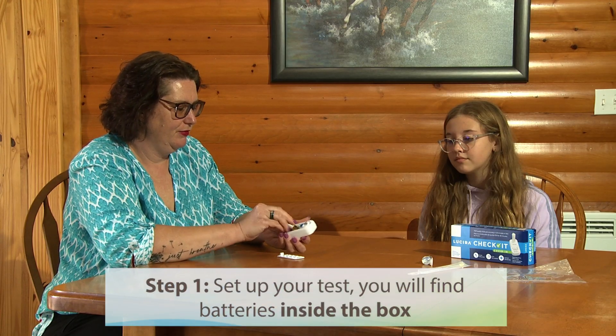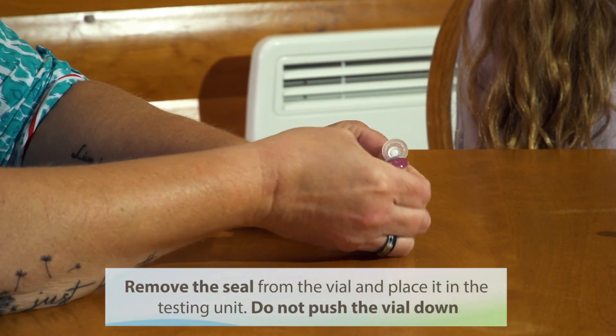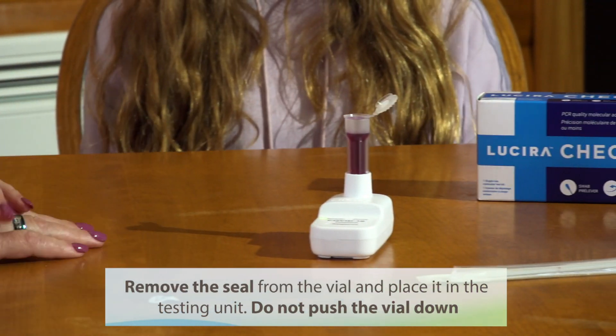Step 1: Set up your test. You'll find the batteries in the box. Remove the seal from the vial and place it in the testing unit. Do not push the vial down.